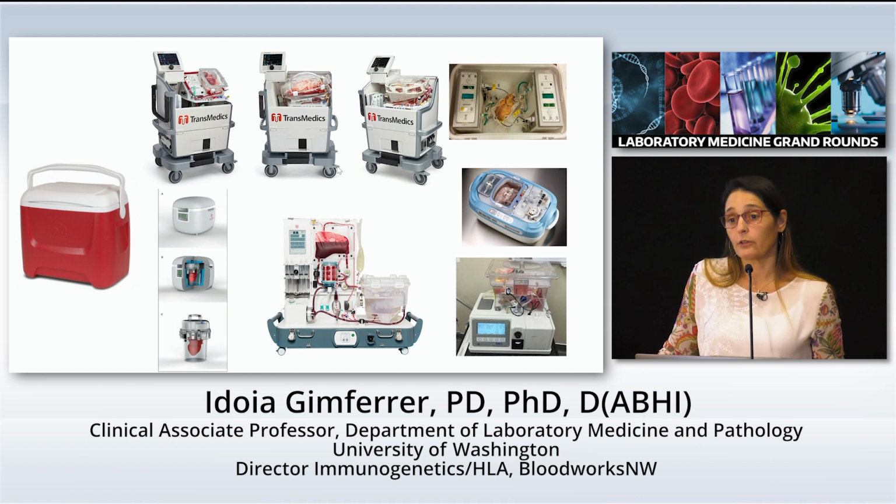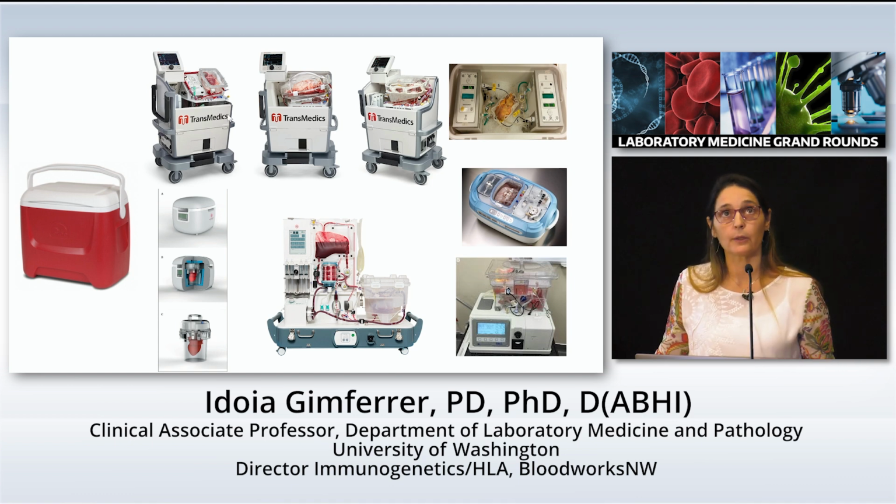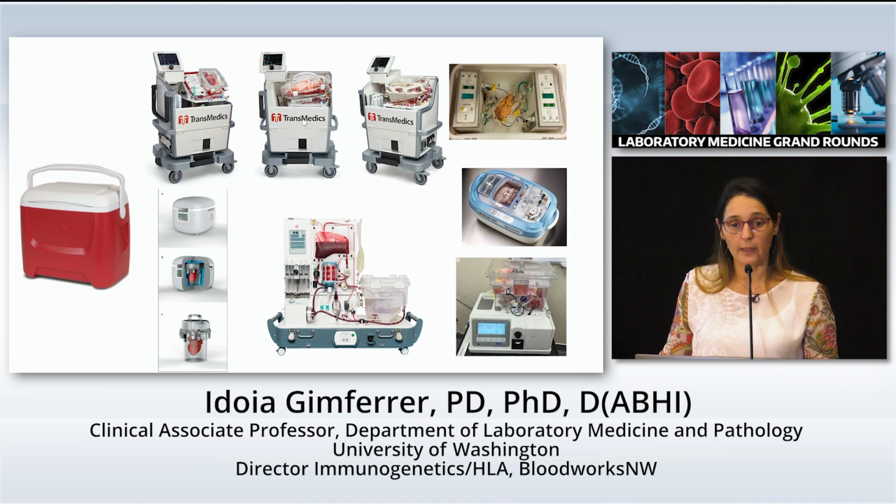And also you can monitor the functionality of the organ, because you can collect the liquid that is going through the organ. It's a pump pumping some media inside the organ. So we have moved from here to there. It's still not for every kidney. If it's a local donor, usually it's more like this. But if you have to ship them far away, then they try to put them in pumps. And this is also better for the organs that are not as good because they are coming from elder people. Then this is much better for this kind of organs.